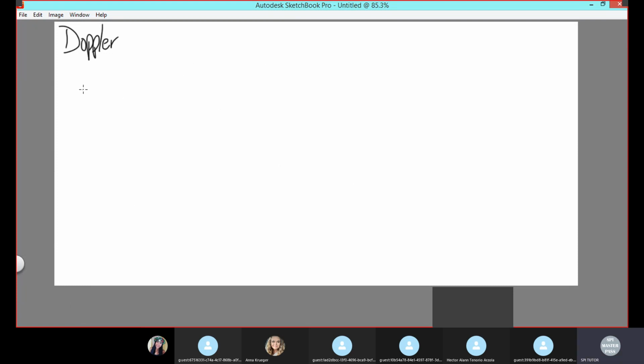Now let's get into some continuous wave versus pulse wave. And these two guys are opposites of each other. Okay, complete opposites. This guy has two crystals to do one job. This guy has one crystal to do two jobs. So already they're beginning opposites. Even in the name, one is continuous and one is pulse. A pulse has a break in between, right?